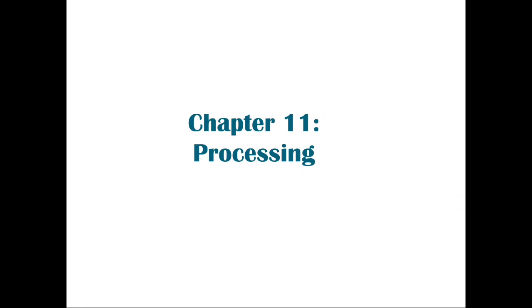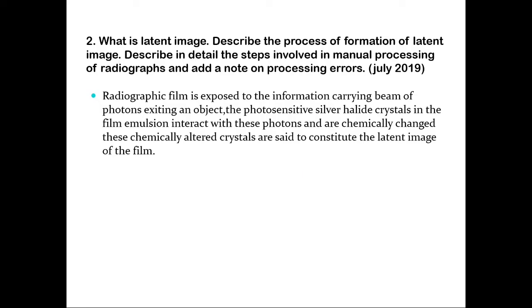Next chapter is about processing. The question that can be asked in processing is, what is latent image? And then describe the process of formation of latent image, describe in detail the steps involved in manual processing of radiographs, and then add a note about the processing errors. The processing errors part we have already mentioned. Now we just have to talk about what is a latent image.